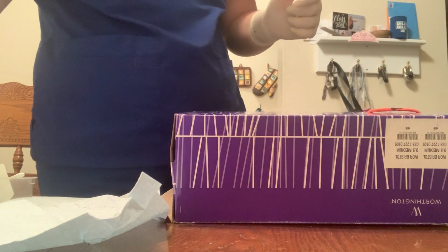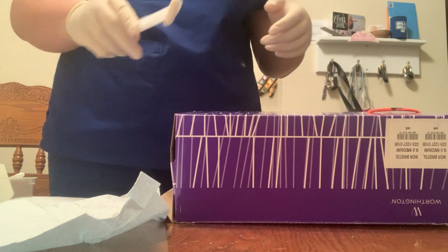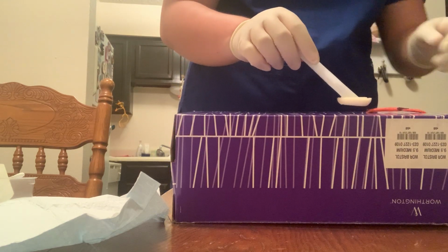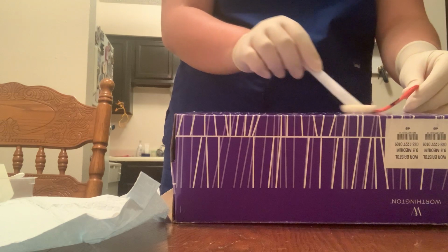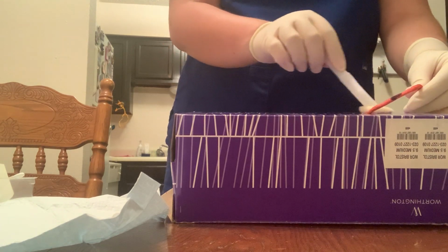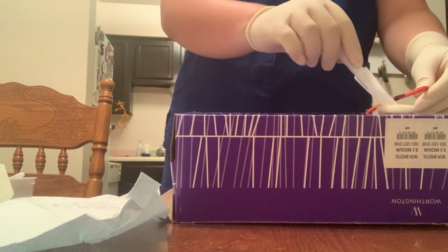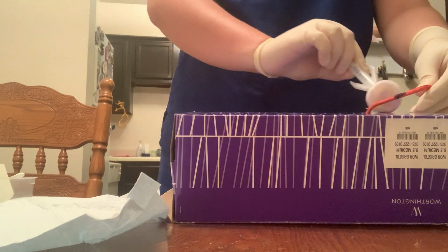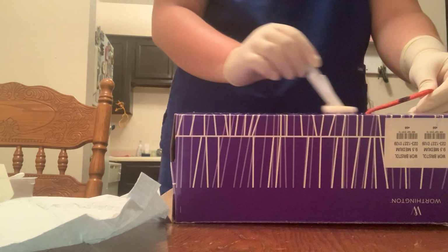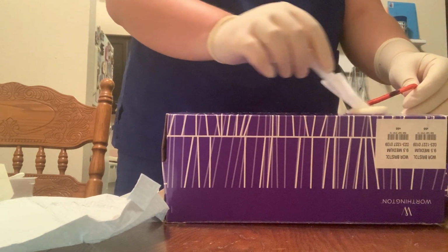Next, I would clean with my chlorhexidine, and to do that, I would squeeze it, and then I would go back around it, cleaning vigorously in a horizontal and a vertical motion, making sure not to go past. And then I would do this vigorously for 30 seconds.